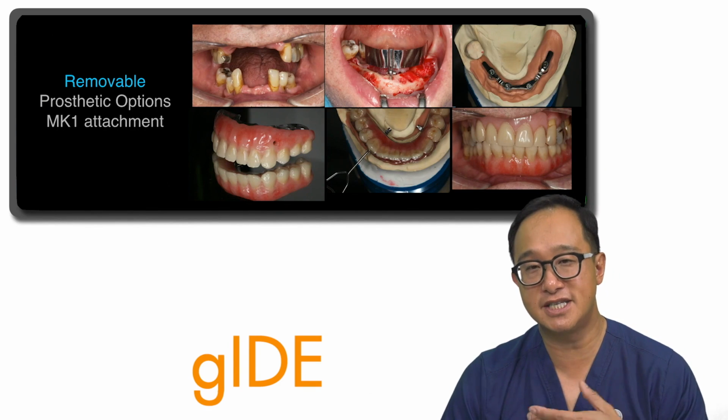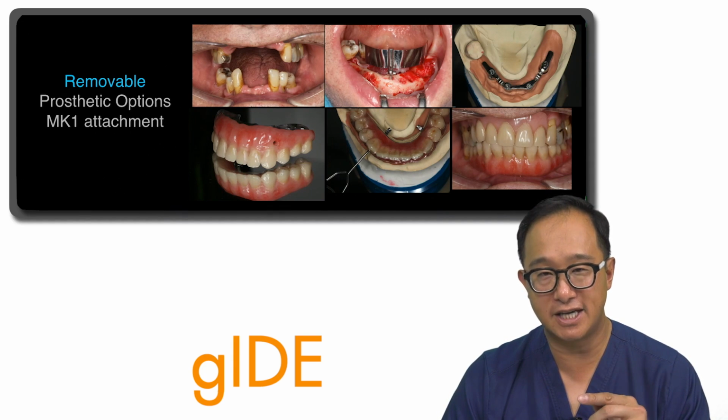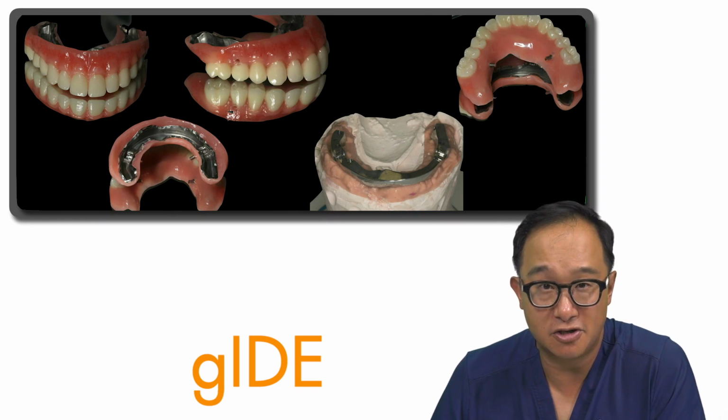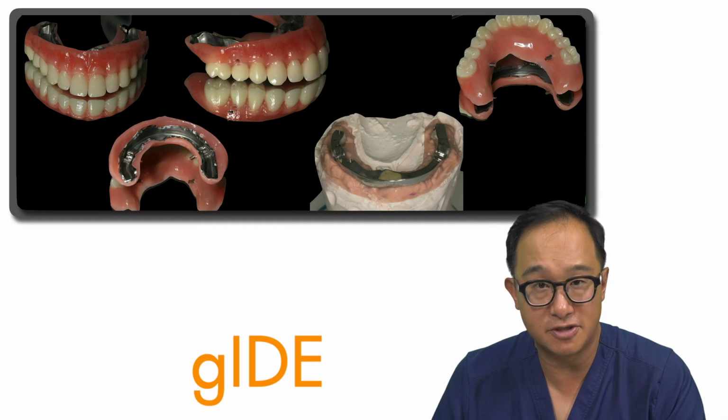But when they want to disengage and remove the overdenture, they use it like a little key, which pushes the pins out on the lingual, as you can probably see. And once they push out, it allows the prosthesis to come out vertically. So it feels like it's fixed, but it's also removable for the patient. So with this patient with a severe resorption that's occurred, that's probably more than 10 millimeters, we need to have a removable type solution.